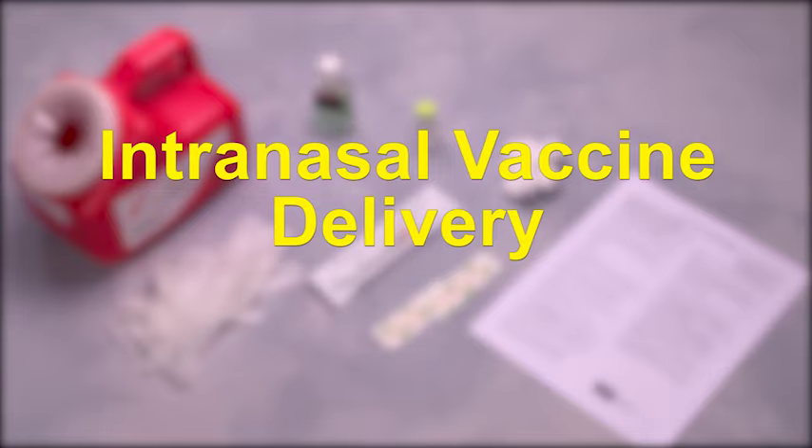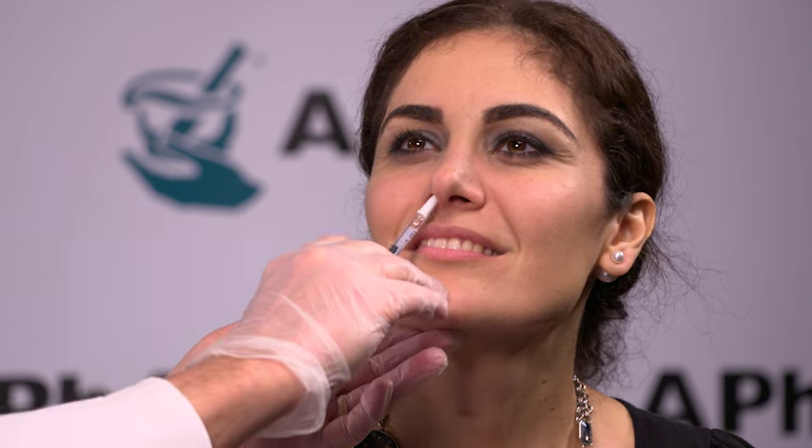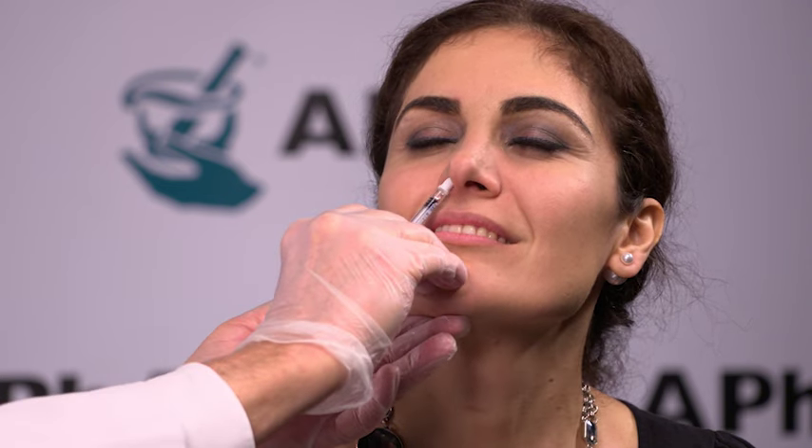The following is a demonstration of intranasal vaccine delivery. Be sure your patient is sitting. Hand your patient a tissue to hold. Remove the rubber tip protector. Some degree of force is needed to deliver the intranasal vaccine. The patient should be in an upright position and the patient's head should be tilted back slightly. Place the tip inside one nostril. With a single motion, depress the plunger as rapidly as possible until the dose divider clip prevents you from going further. Remove the tip from the patient's nose and then remove the dose divider clip. Administer the remaining dose into the other nostril. Discard the syringe into a biohazard container. Provide your patient with post-delivery instruction and follow-up instructions. Document the immunization given while maintaining compliance with all legal requirements for documentation.